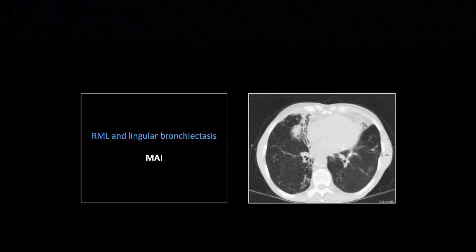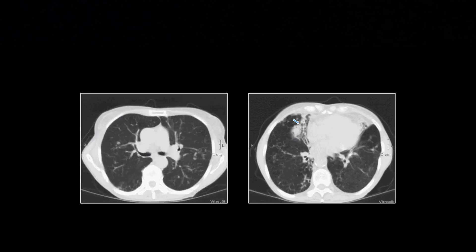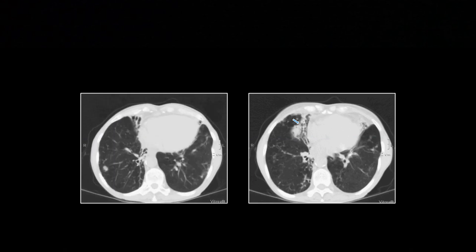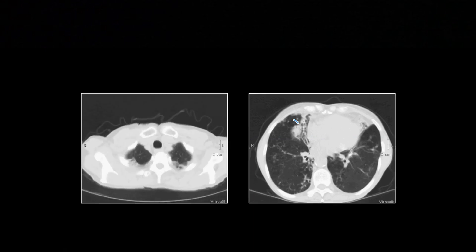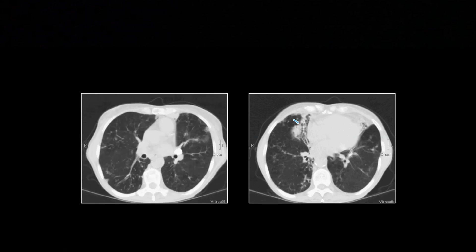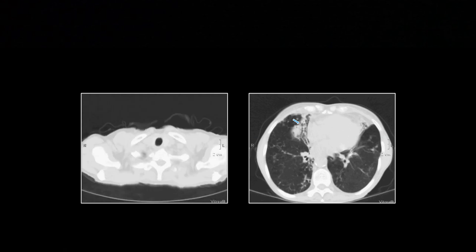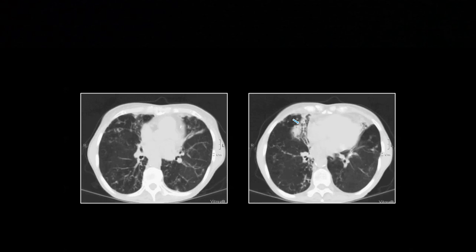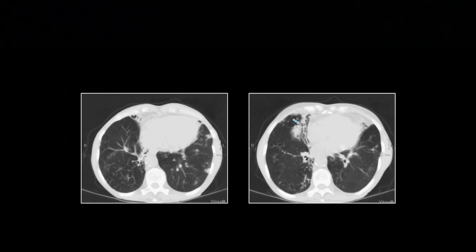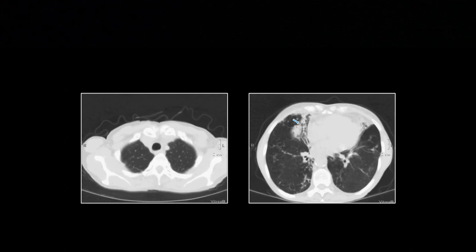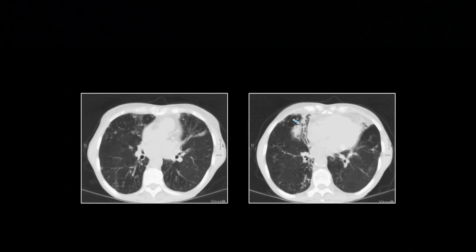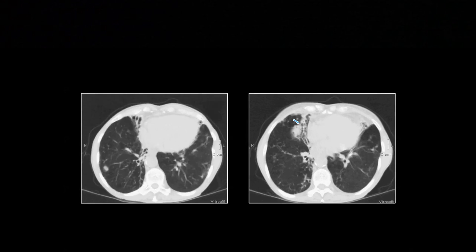Another tuberculosis pattern: this is the classic Lady Windermere finding — right middle lobe and lingular bronchiectasis. Bronchiectasis in this distribution, especially in an elderly female, should immediately call to mind MAI: Mycobacterium avium intracellulare. It's often a chronic colonization, and these patients are not horrifically sick. It's usually elderly females, oftentimes institutionalized.